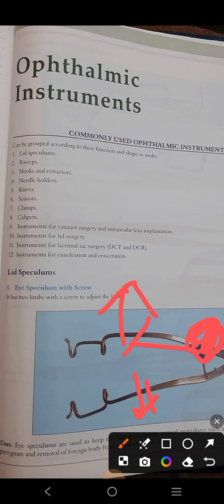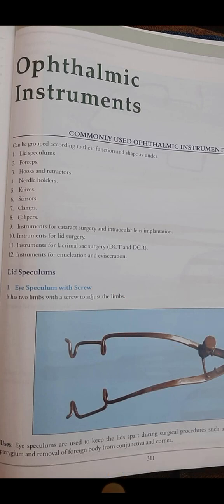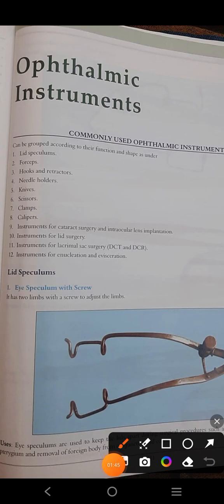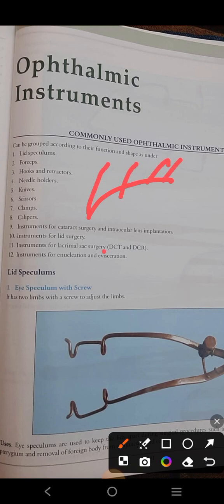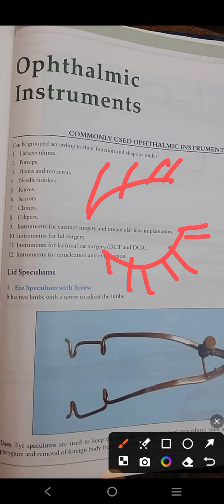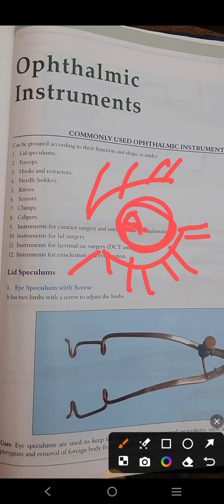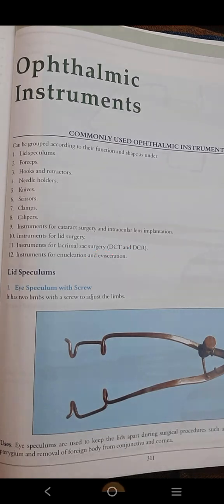The use of the eye speculum is mainly to keep the lids apart in any type of surgery — like pterygium surgery. Pterygium is a fibrovascular meshwork projecting from the conjunctiva towards the cornea; it is triangular in structure. In any type of eye surgery where you need to keep the two lids apart to approach the eyeball and perform the operation, you use the eye speculum — whether for pterygium, removing a foreign body from the conjunctiva or cornea.